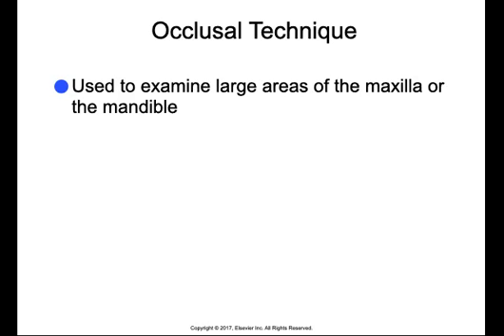So the occlusal technique is used to examine large areas of the maxilla or the mandible. This technique is so named because the patient bites on or occludes on the entire receptor.